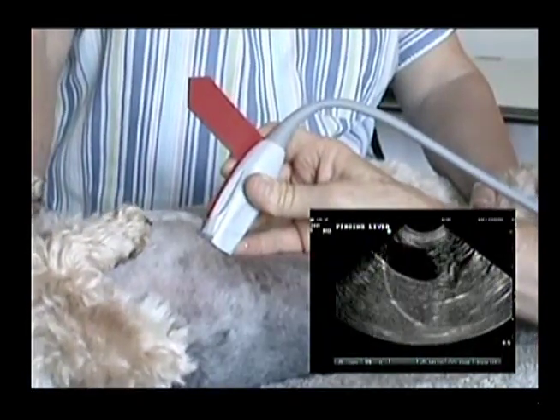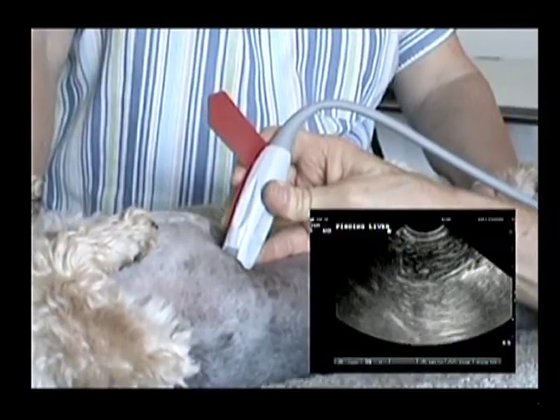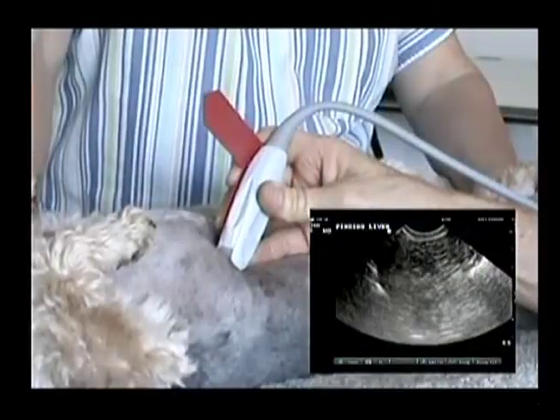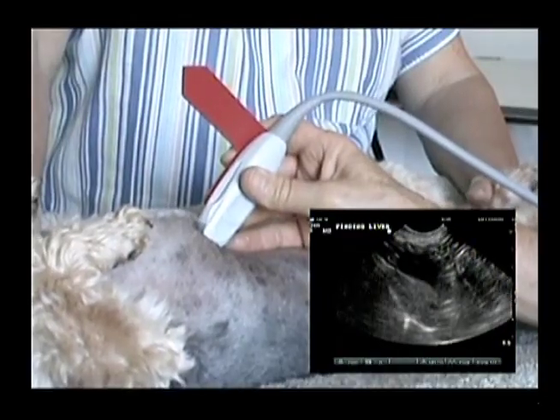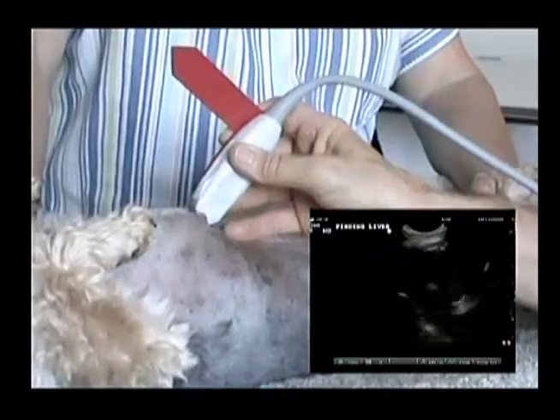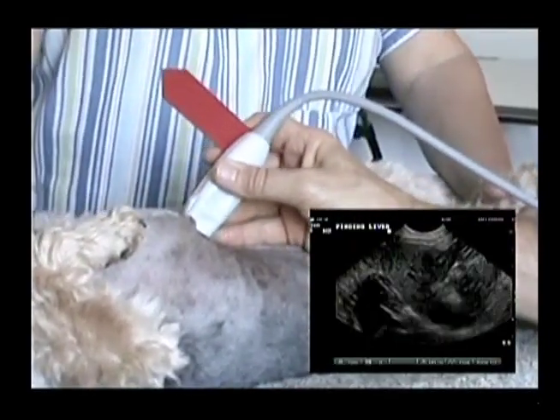In addition, some patients may have injuries, respiratory distress, or some other clinical complication that may require a different patient position or transducer position to find and evaluate the gallbladder. You need to be flexible and move the transducer to whatever position is needed to see the gallbladder.